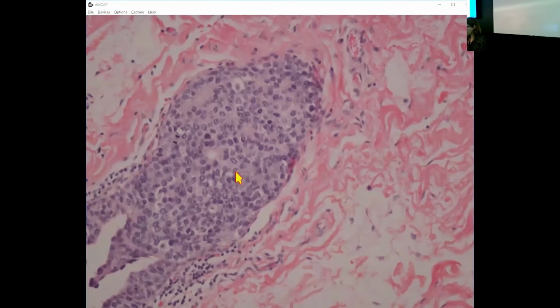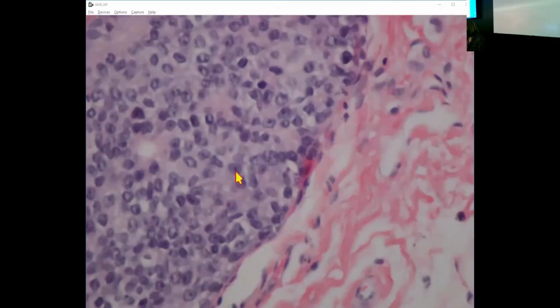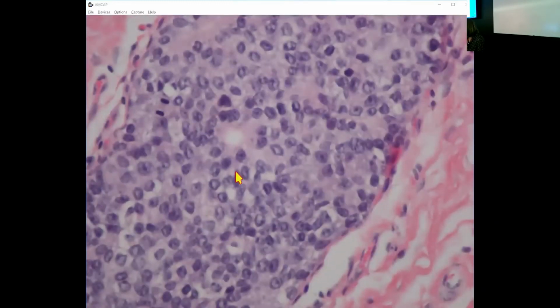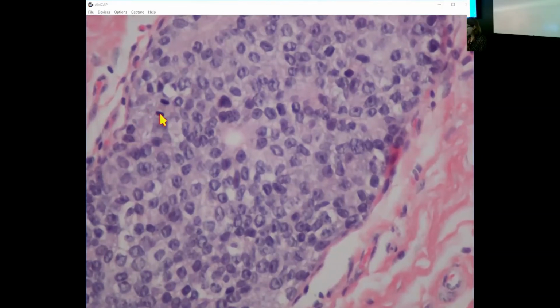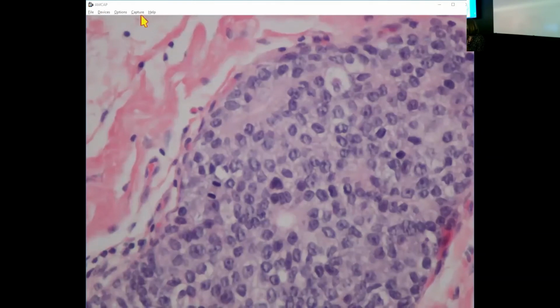But as you start to look at it, I think the nuclei, while they vary a little bit in size and shape, do have a similar quality one to another. It's not perfect, of course, because you're going to have some dark nuclei. There is a mitotic figure, so that would lean me towards DCIS versus UDH, but that's not to say that you can't have mitoses in UDH.